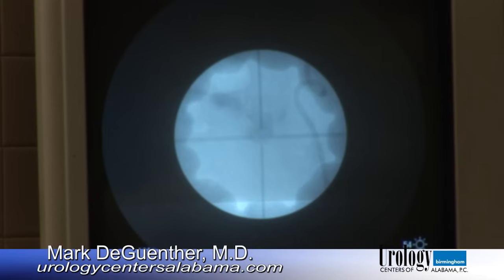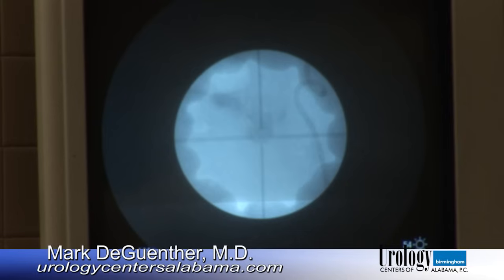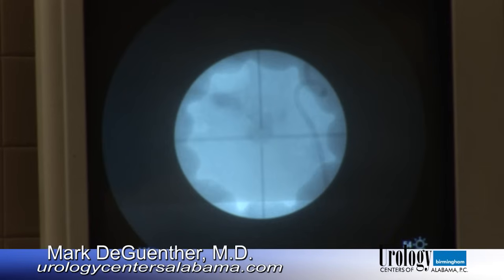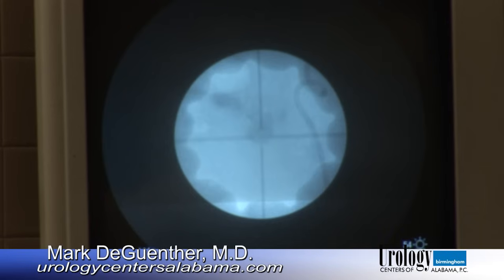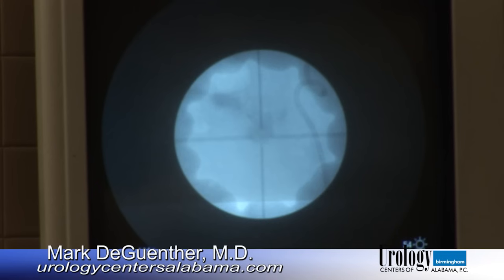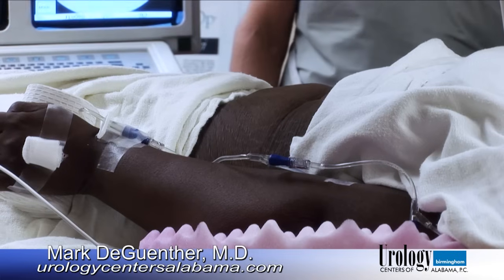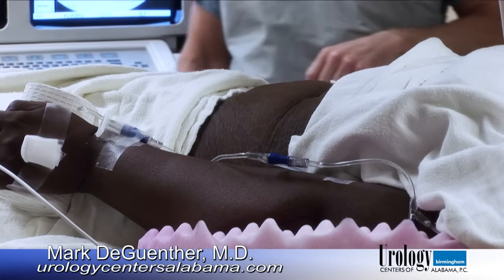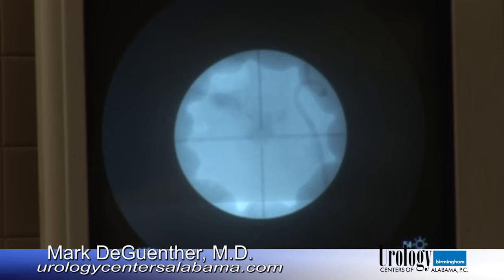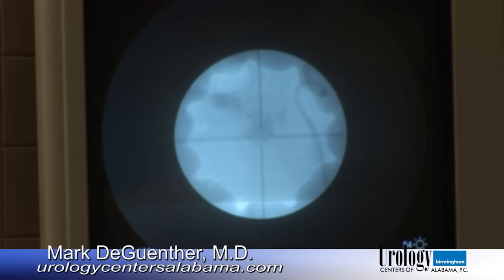What we see here, using real-time x-ray imaging called fluoroscopy, we are centering the crosshairs on this stone in the lower part of the kidney. And once we're satisfied that we have everything set up with the stone in the proper position, we will then begin creating the shockwaves.